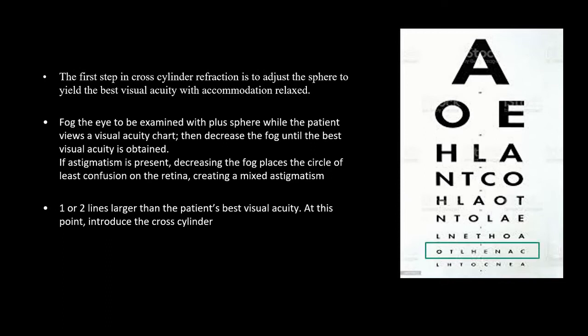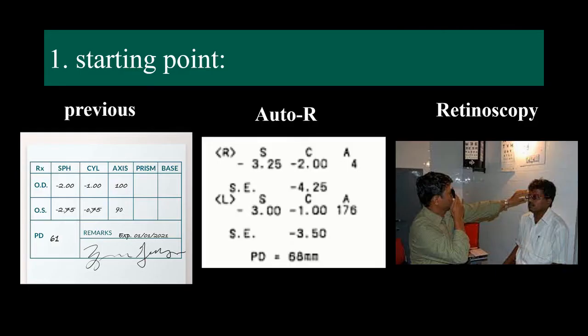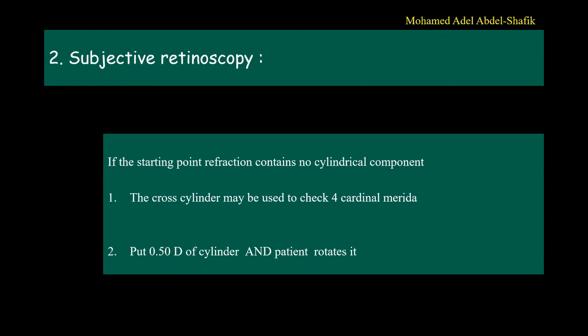Then ask the patient to look one or two lines above the best vision so he can notice changes. Then we're going to use the cross cylinder. The starting point can be the cylinder in a previous prescription, the cylinder in the auto-ref results, or the cylinder in the retinoscope. Another way to check for the cylinder is by subjective retinoscopy. If the starting point contains no cylindrical component, we can use the cross cylinder in 4 cardinal meridia to check for any astigmatism, or we can use a cylinder from the trial case.